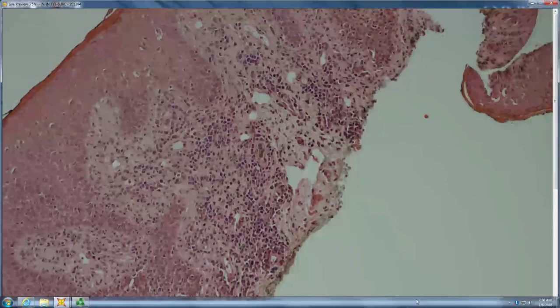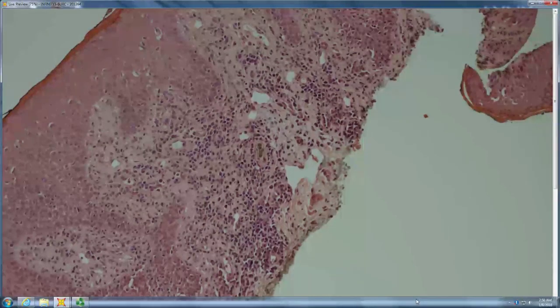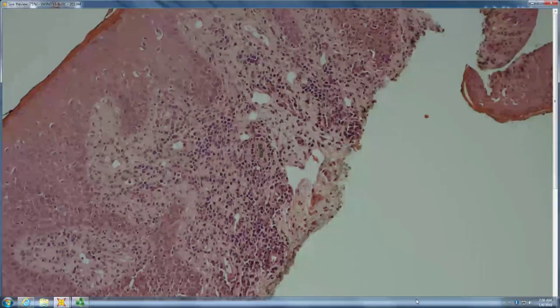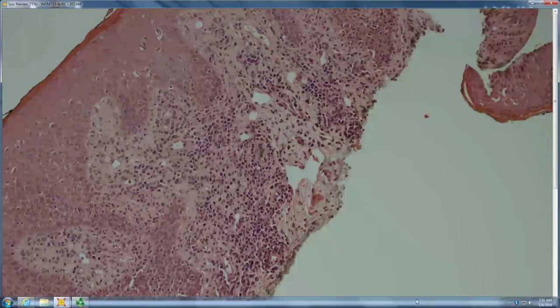So a number of the STDs take their plasma cells with them from the mucous membrane when they go elsewhere. That can help you sometimes. So it could be site, it could be innate to the condition. Certainly syphilis does it. Another one that's famous for doing it is leishmaniasis. Leishmaniasis often has a big plasma cell infiltrate.